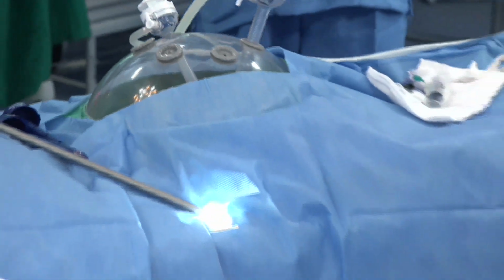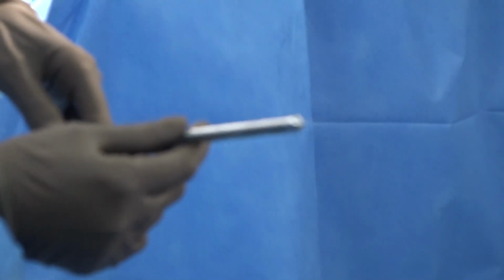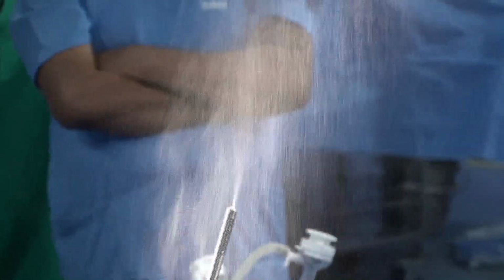So this is how the particle size, as I told you, is 25 micrometer. It's very small, so it goes inside the abdomen. Now they have come up with a modified tip also, called the capno tip, which has an omega kind of a thing there, and the spray angle becomes 150 degrees. And then there is something called electrostatic PIPAC also, in which they use a charger so that distribution inside the abdomen is very homogeneous. But we have to be very sure that there is no OR contamination here.